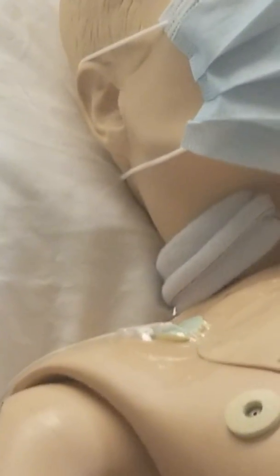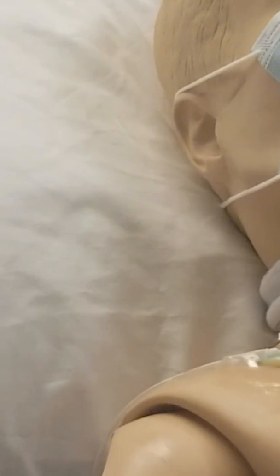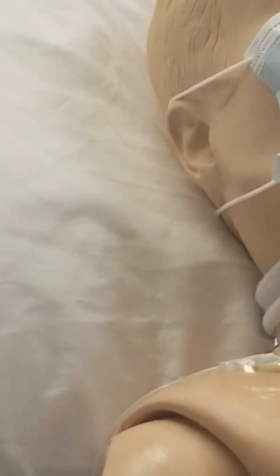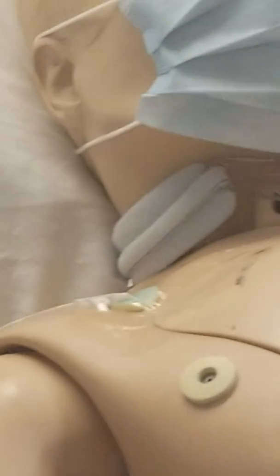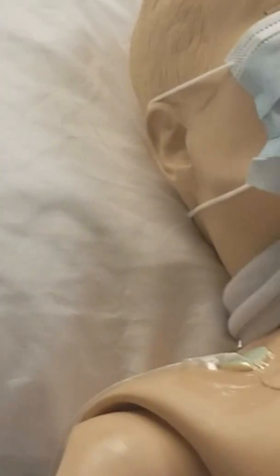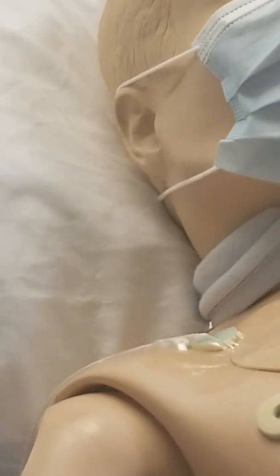So at this point, you got to what? Label it, sign and date it. So you can take your gloves off if you want to. Put your initials on here, but you don't need to be sterile anymore. Throw this away. So sterility can stop after we put the chlorhexidine and then you attach the dressing. Put your dressing on. Then hand hygiene, you can put on clean gloves.